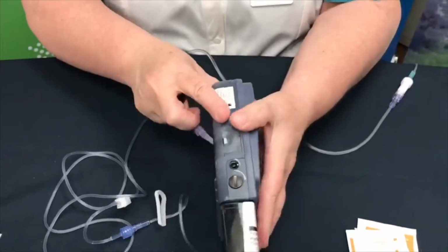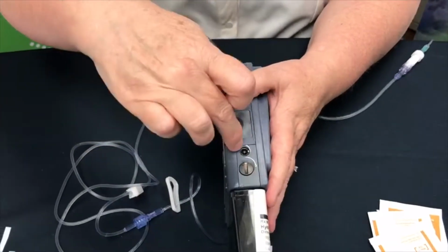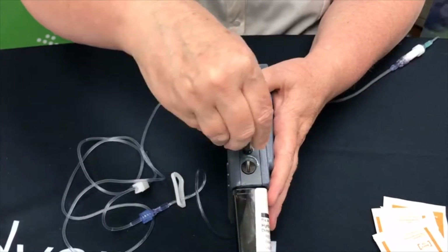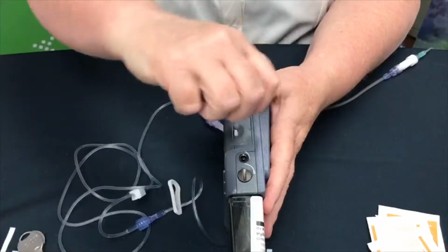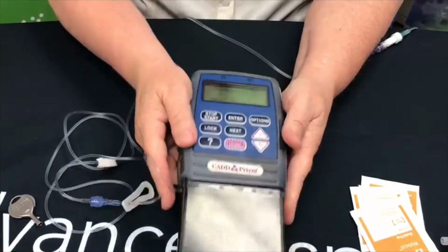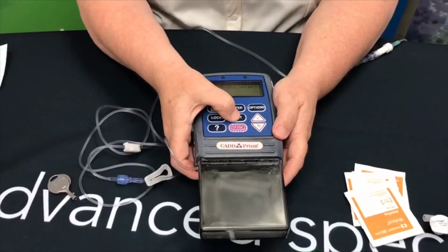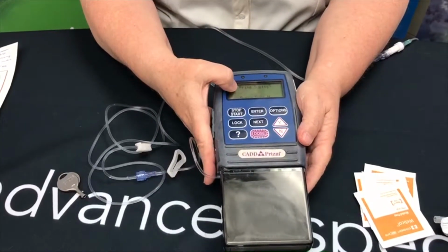To lock the cassette, I take the bottom of my CADD pump key, place it in this hole here, and turn it to the left. That locks it, and it tells me on my pump that my cassette is locked. Now it says press next to continue. If I press next, it asks me if I want to prime the tubing.